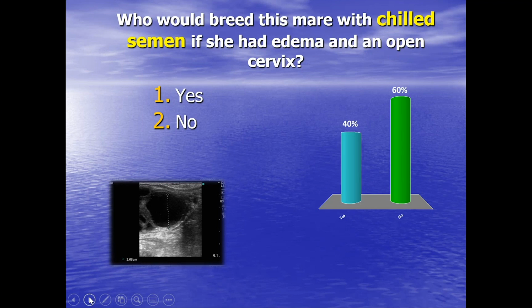What are we going to do? Maybe take a punt. This mare may well be ready to inseminate in 24 hours and ovulate within 24 hours after being inseminated. So it could well be the 40% category. Yes, let's order semen for the next day, put it in, and hope she's ovulated 24 hours after putting the semen in.